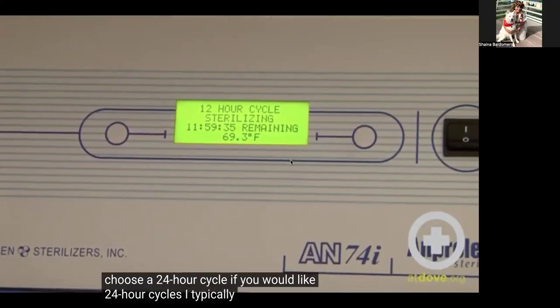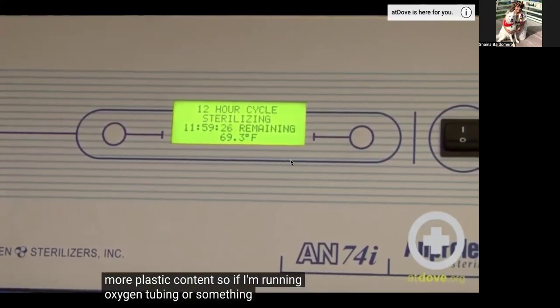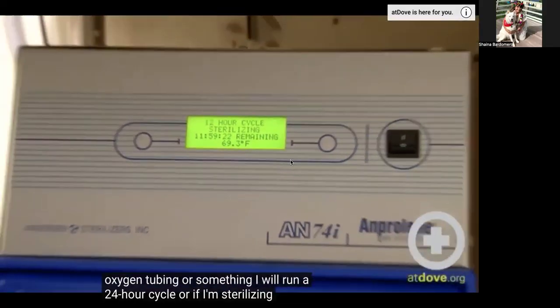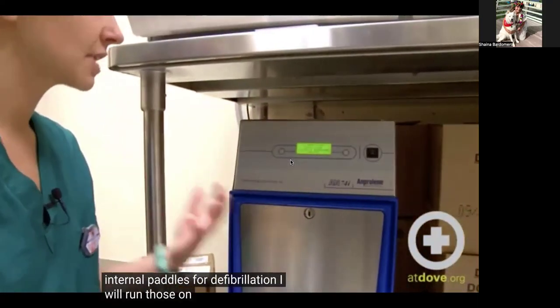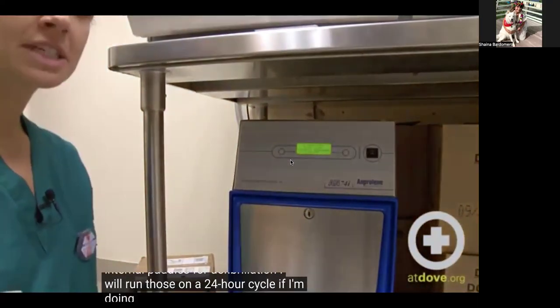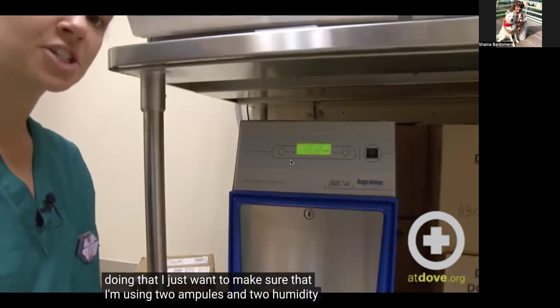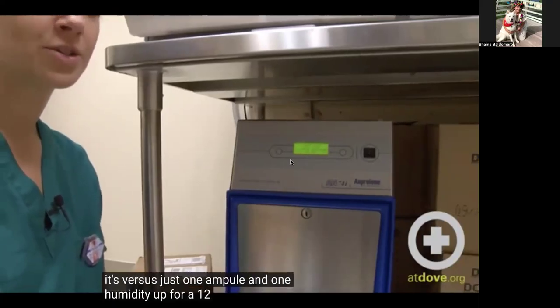24-hour cycles I typically use when I'm running quite a few items, things with more plastic content. So if I'm running oxygen tubing or something, I will run a 24-hour cycle. Or if I'm sterilizing our internal paddles for defibrillation, I will run those on a 24-hour cycle. If I'm doing that, I just want to make sure that I'm using 2 ampules and 2 humidity chips versus just 1 ampule and 1 humidity chip for a 12-hour cycle.